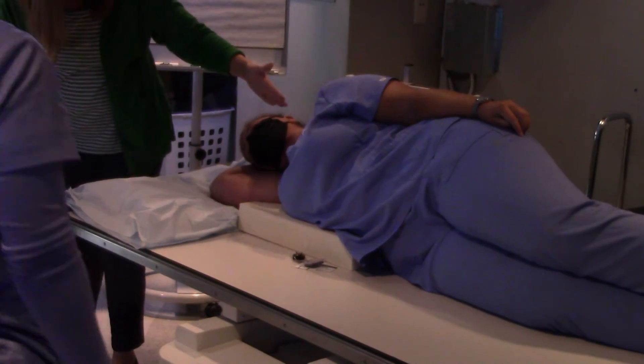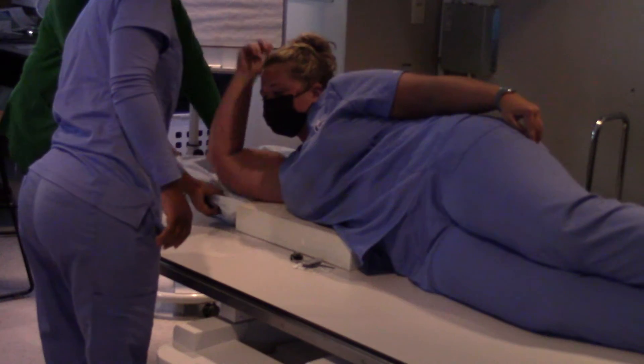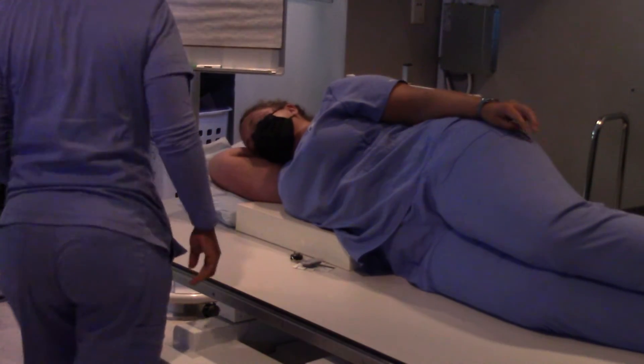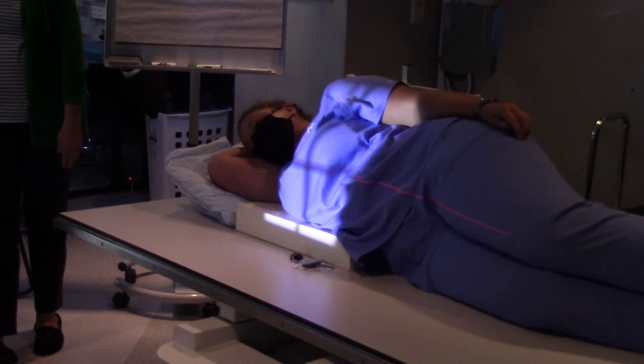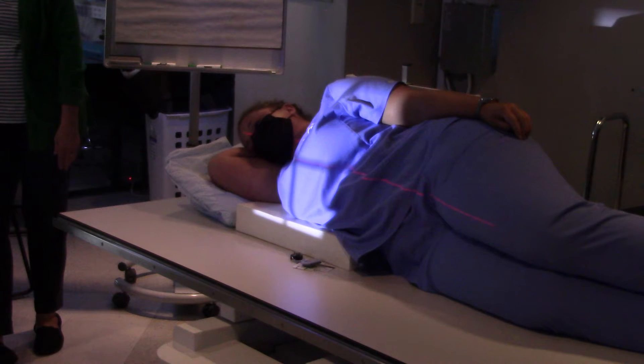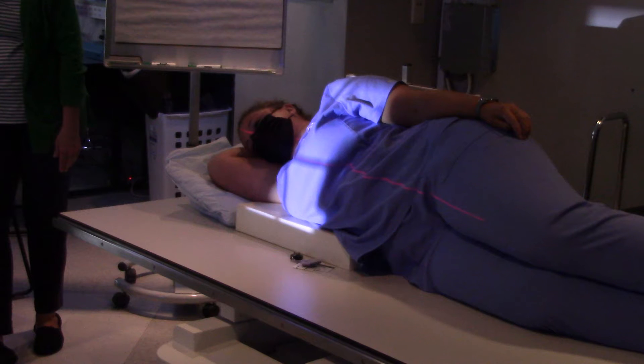Especially for a decubitus, you can also build their support up. Whenever somebody is laying on their side, their tissue is going to be drawn down by gravity, so their midline is going to be thrown completely off. You can't use a lot of anterior anatomy anymore — because of gravity. But their spine is not going to move, unless they've got serious issues.